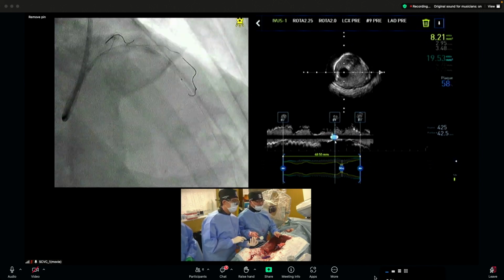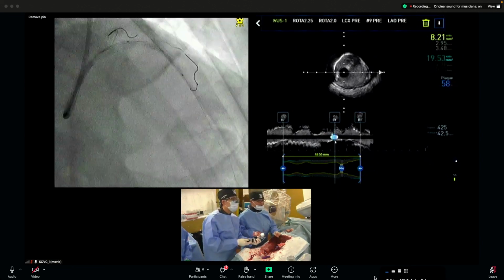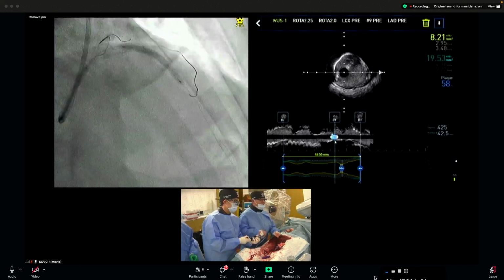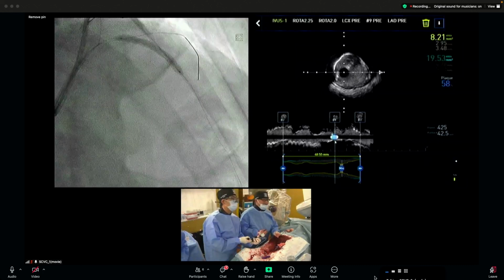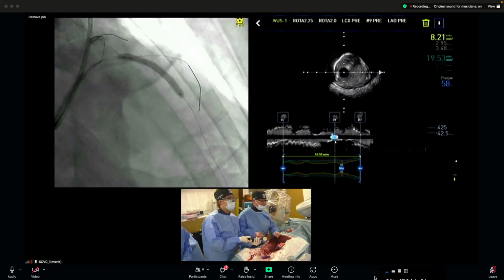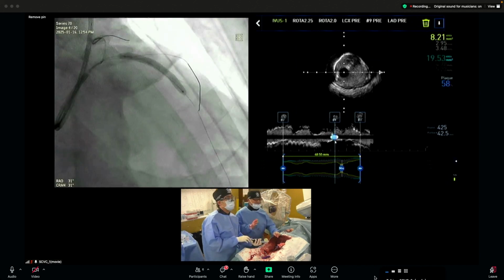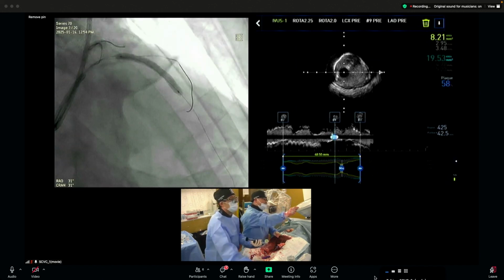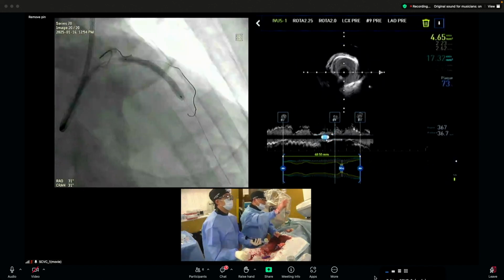So now I'm not using it for the calcified lesion. Yeah, but of course I choose Megatron stent for the proximal. So why do I choose synergy stent for this side? This is so easy because the stent overlap point is around the diagonal branch.